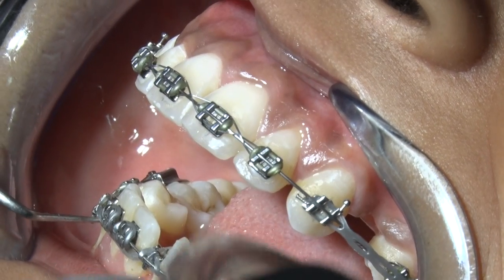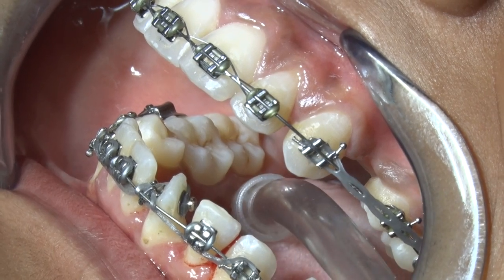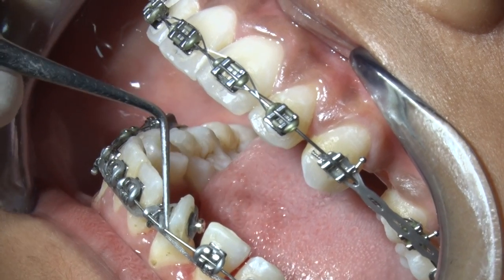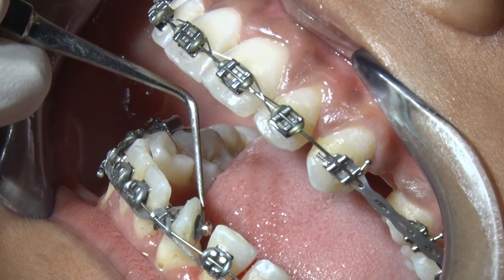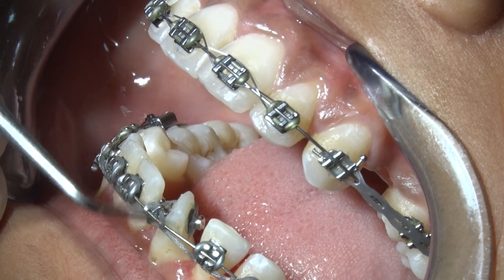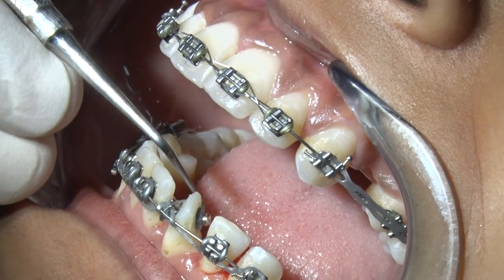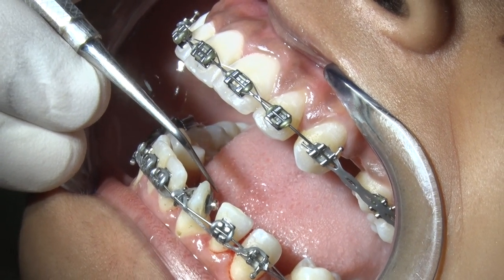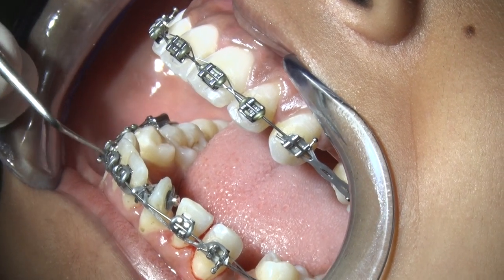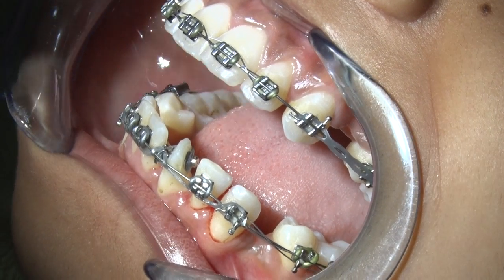One force acts from here, and two forces act in the opposite direction. This part will move towards the palate and towards the lingual side, and this will move towards the labial side. The main point of action is the surface over here and the surface over here.